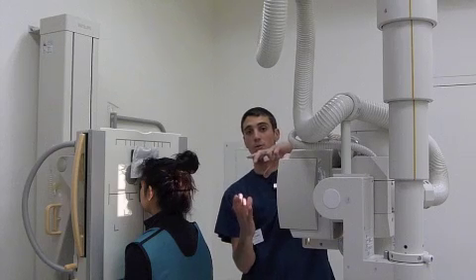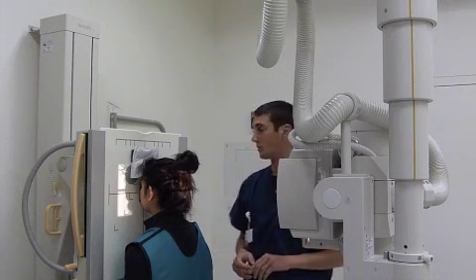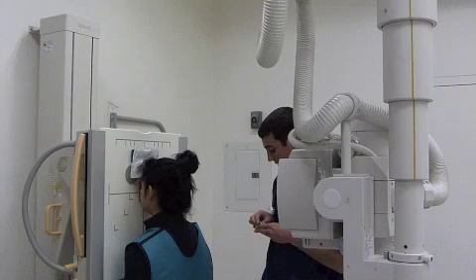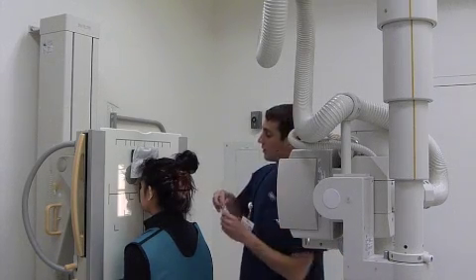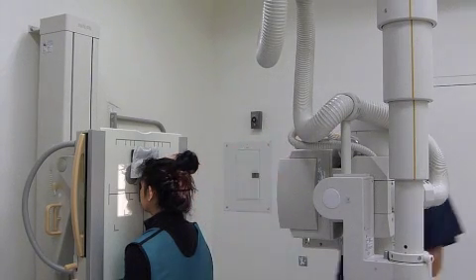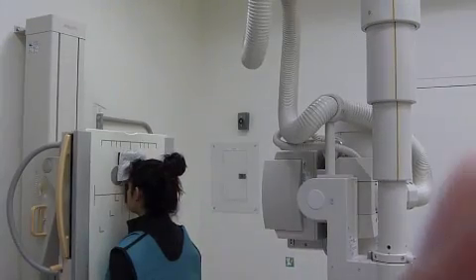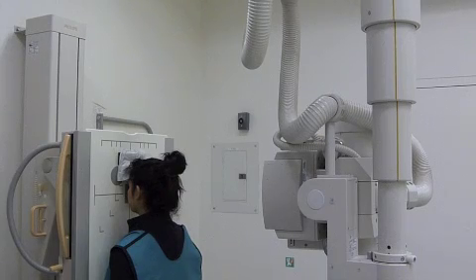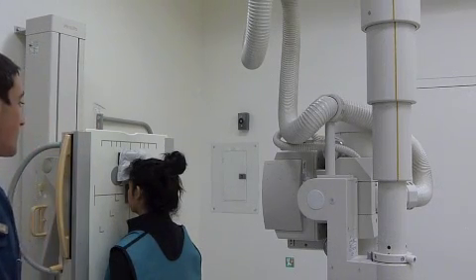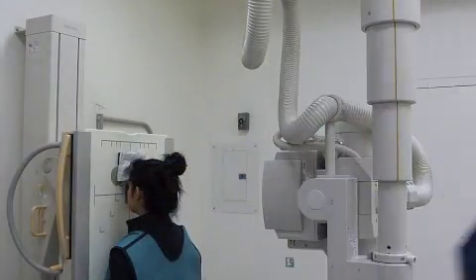and I do have a cone on the tube, but we do not have any here, so we will imagine that is on there. And I will put my right marker on the right side of the patient, and the technique I'll be using for this is 75 at 20 mAs. And I will now go and take the image.